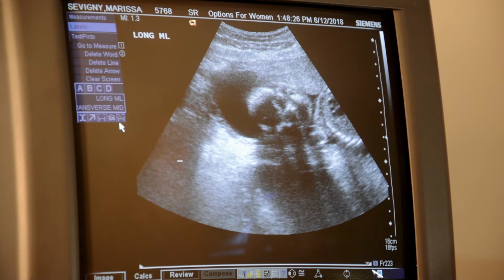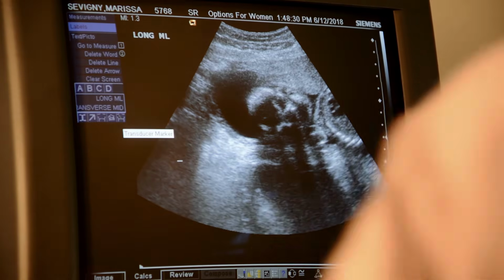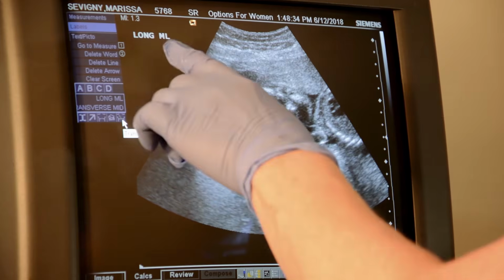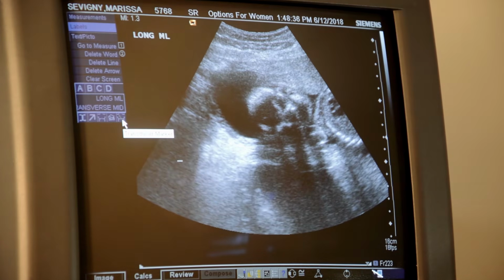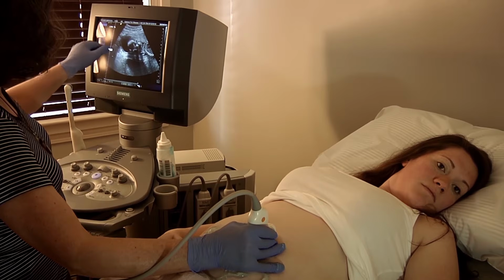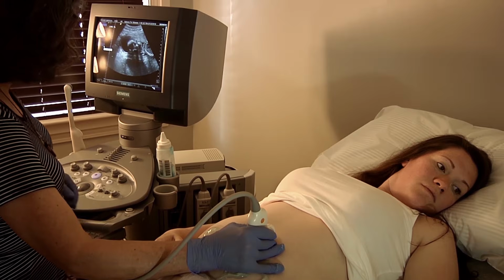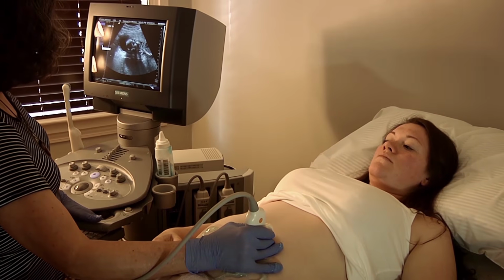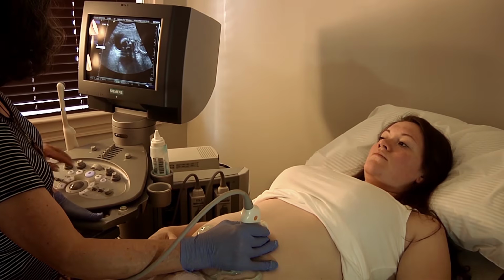Everybody see this? And this is the edge of the placenta, okay? And that would be the sag midline upper. You don't have to write upper. You just go ahead and print that or save it. Oh, I still have one, two. It is. It's the midline, but it's the upper. Yep. Erase that. Yeah, that's good.